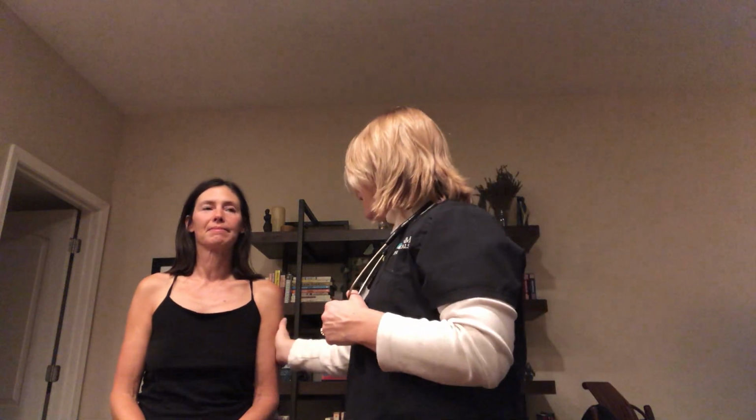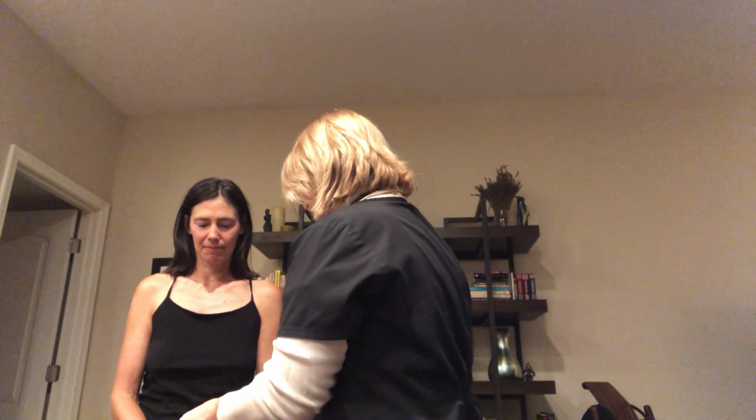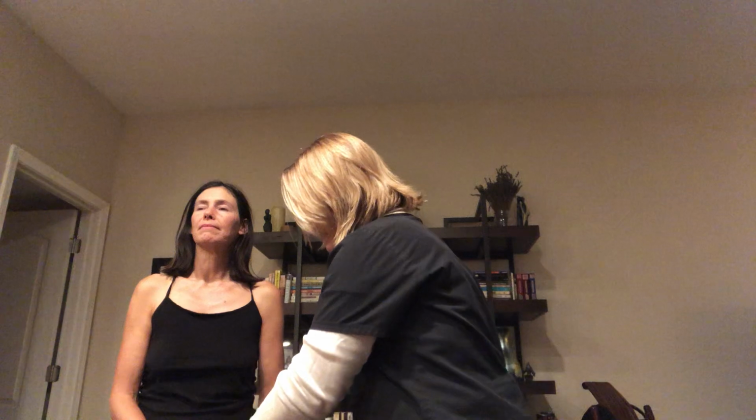I used a manual cuff. She's 110/65 with her blood pressure. Actually, I did not do the pulse ox yet. I will check that right now to see what her heart rate is and her oxygen level. I did her temperature, and that is 98 Fahrenheit or 36.6 degrees Celsius. Her BMI is 20.4 because she's 5'7" and 130 pounds. And her blood oxygen is 99, and her heart rate is 66.